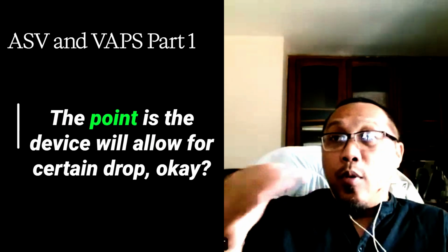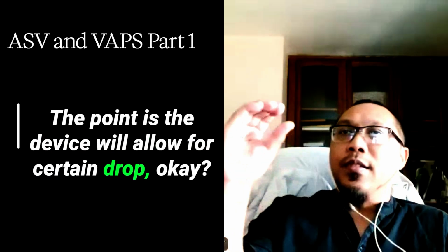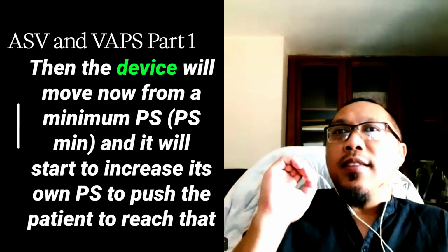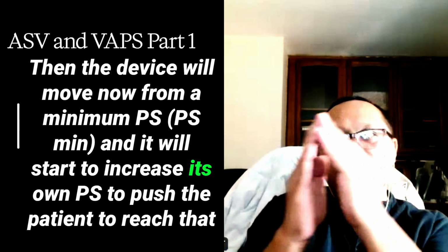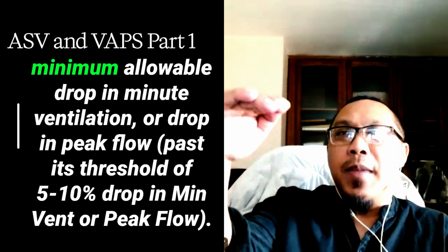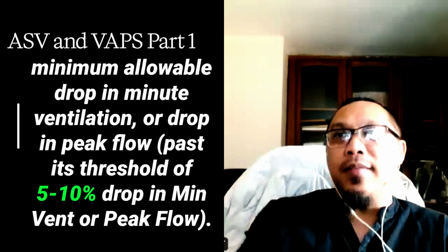The point is, the device will allow for a certain drop. But as soon as you drop further, the device will move from a minimum pressure support and start to increase its own pressure support to push the patient to reach that minimum allowable minute ventilation or peak flow.